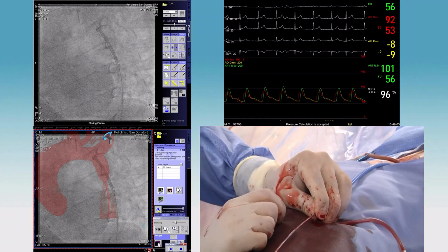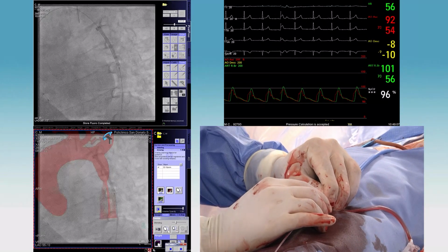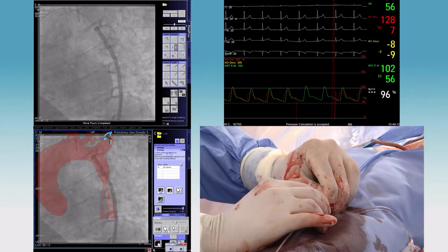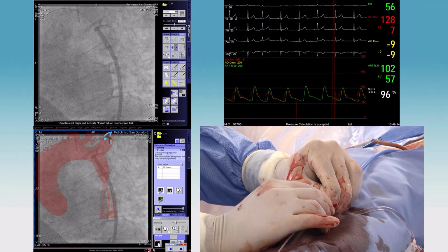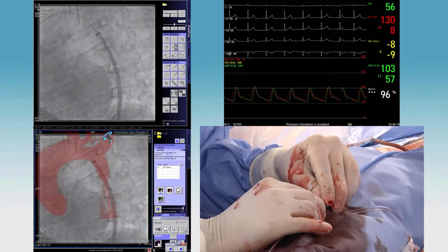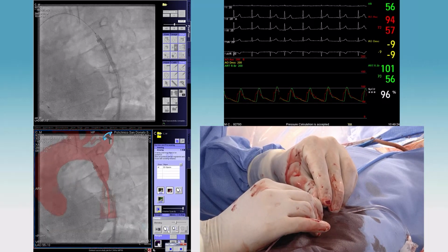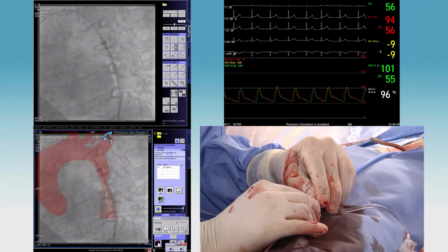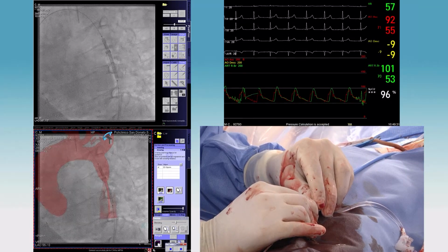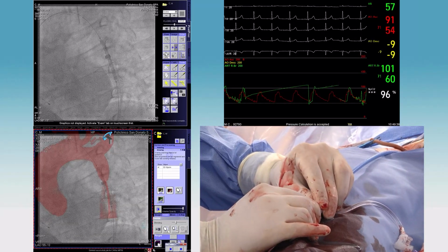So we need to do a check angio. Okay, so do a proper angio. There's the left subclavian. So let's half expose, just 50%. So we're just pulling the sheath back, a little bit more exposure. About there, yeah. Do an angio. Go. Ready?